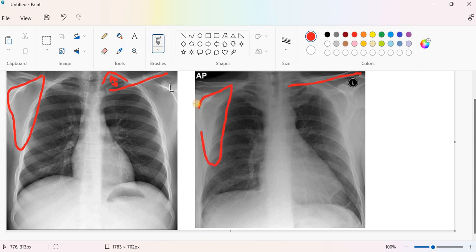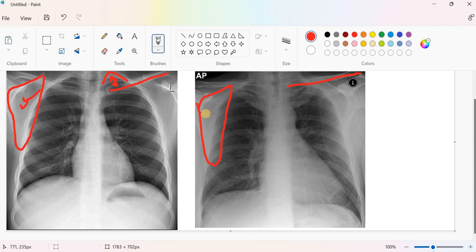So here the scapula is extremely peripheral. Here the scapula is part of which is encroaching on the lung field.